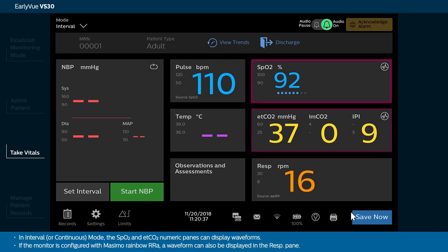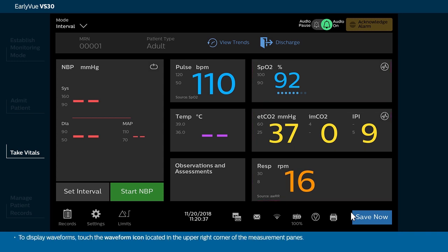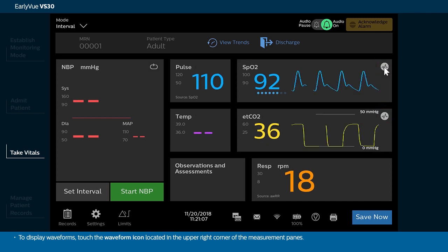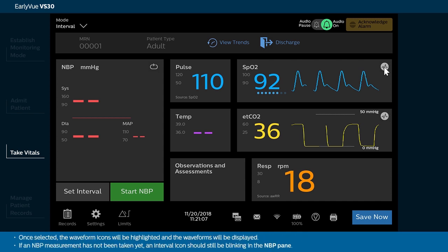In interval or continuous mode, the SPO2 and ETCO2 numeric panes can display waveforms. If the monitor is configured with Masimo Rainbow RRA, a waveform can also be displayed in the RESP pane. To display waveforms, touch the waveform icon located in the upper right corner of the measurement panes. Once selected, the waveform icons will be highlighted and the waveforms will be displayed. If an NBP measurement has not been taken yet, an interval icon should still be blinking in the NBP pane.